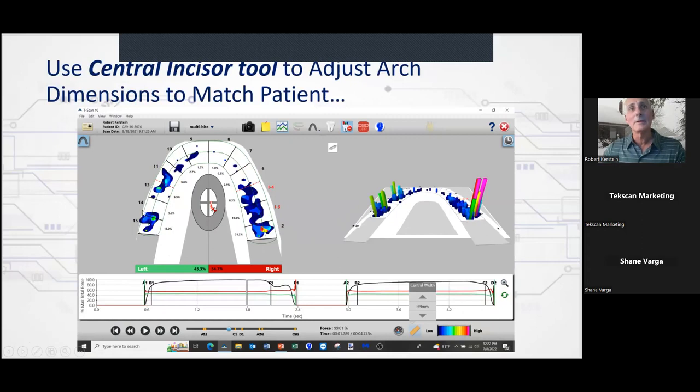Now I have the correct 15 data in 15 and the correct 2 data in 2, and I'm no longer overlapping the third molars. Now, if I want to adjust this contact between 11 and 13 because it's maybe a force outlier, maybe it's too fast rising, it's actually at the distal marginal ridge of 11. And the same with these 2 contacts and the high force contacts on tooth number 2, the central fossa and the distal buccal cusp. So these are essential things to be able to do.